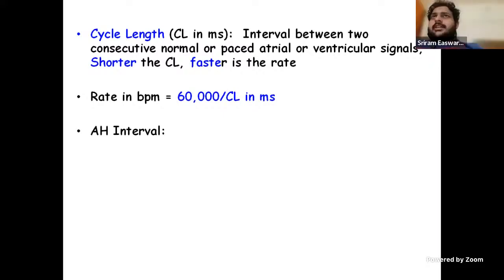It reflects the atrial conduction and the delay from the atrial to the AV node. The total AV nodal delay is made up of two parts, AH and HV interval. The AH interval is the interval from the onset till the impulse has reached the bundle of His.